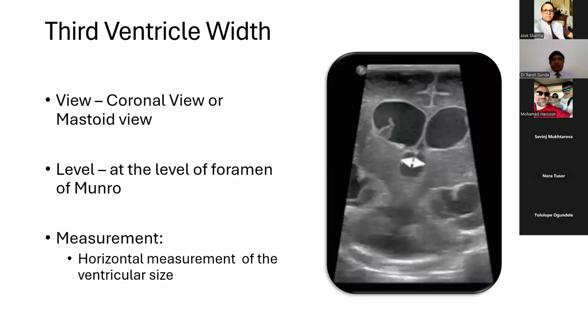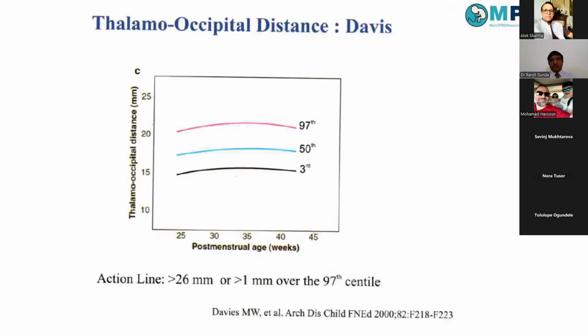So we have sort of finished the lateral ventricular measurements. The ventricular index, anterior horn width, and the occipital distance are the 3 nomograms which are very well described, very much used across the world, and quite objective measurements, useful for serial measurements and making a management plan for the infants that we see.